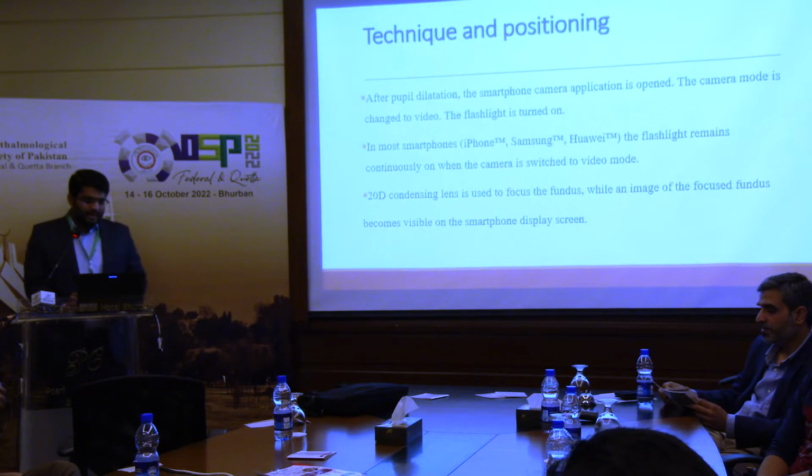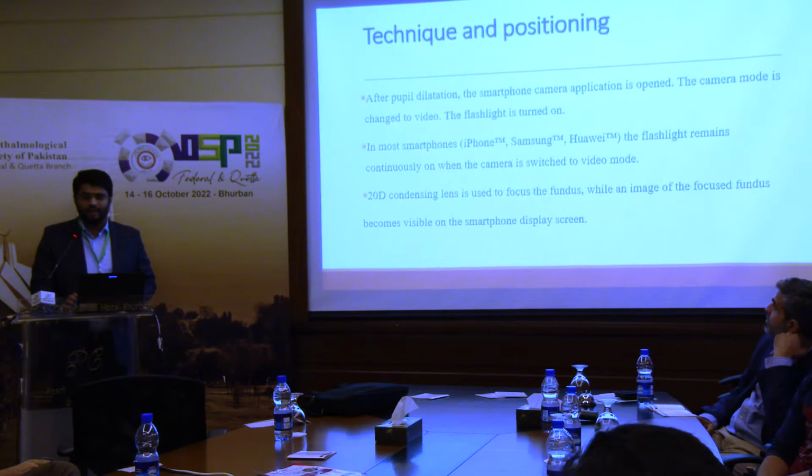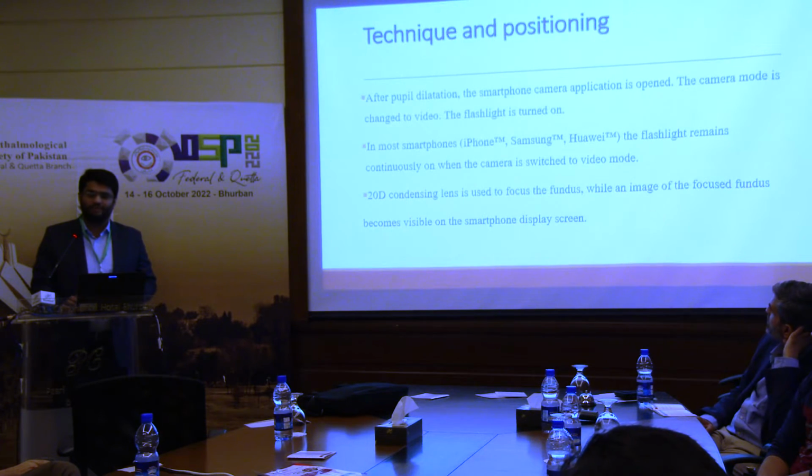The technique is that after pupil dilatation, the smartphone application is opened, and there are different tips related to it. If we go in video mode, then the flashlight remains turned on throughout the picturing, and if we have different apps related to it, then they also keep the flashlight on throughout our imaging process.